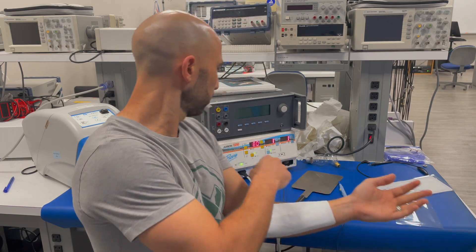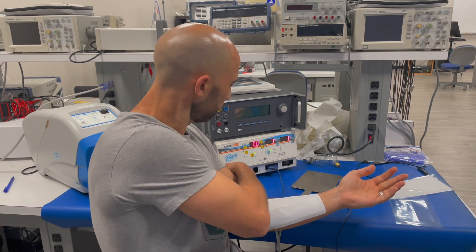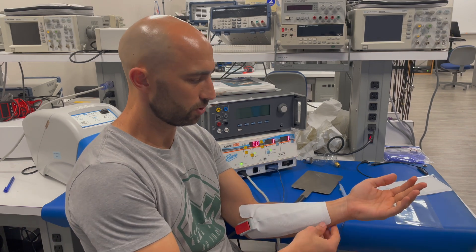Depending on where the surgery is being done, you may have to put it in different places — that's more of a clinical issue. I want to show the safety feature that comes with the split pad electrode. You notice my ESU generator over here: everything's happy, green lights, no alarms, nothing.